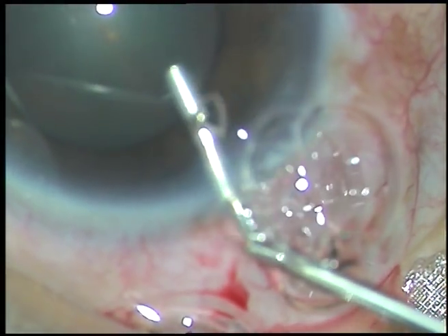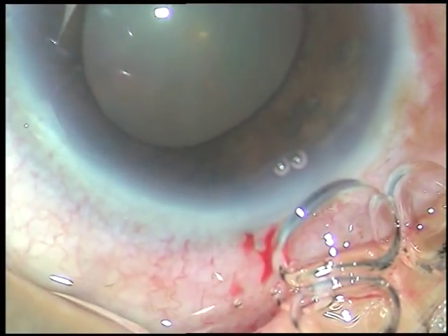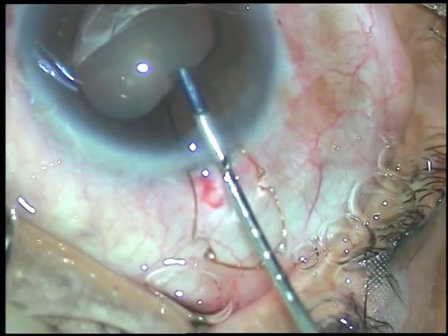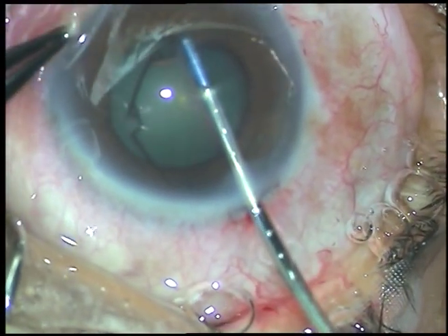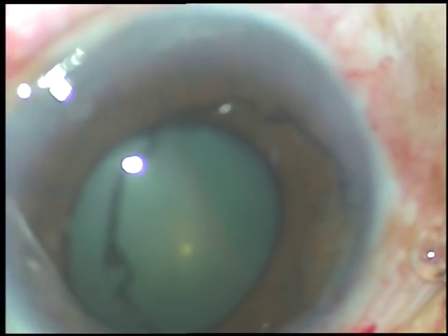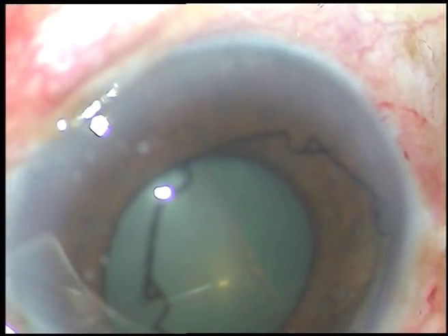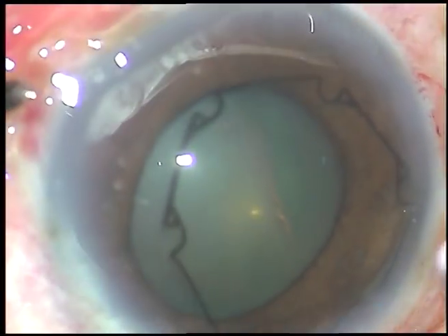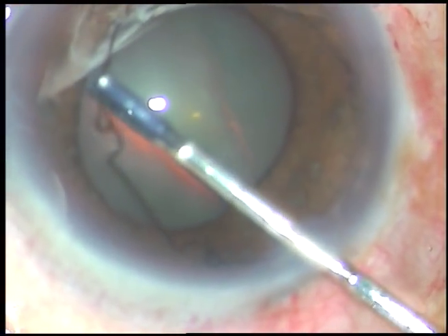The intraocular pressure was 54 mmHg after anti-glaucoma medications, and at that pressure I had to take up the case for surgery. There are a lot of apprehensions that if we take cases with high pressure there can be expulsive choroidal hemorrhage — many speculations are there. But it is not so.